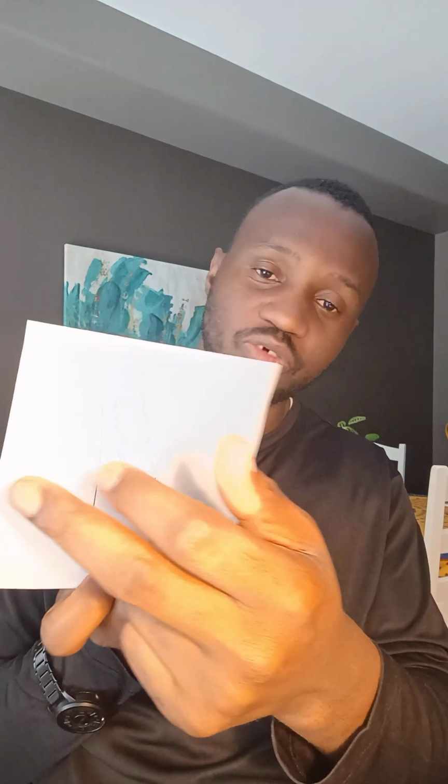And the last part, in my second video, I stopped at looking at measurements, and I said we must take measurements in the three dimensions. If this is our organ here, then we give a sagittal view, and we're supposed to take length and height. Then we are supposed to get a transverse view and take the width. That gives us the volume.